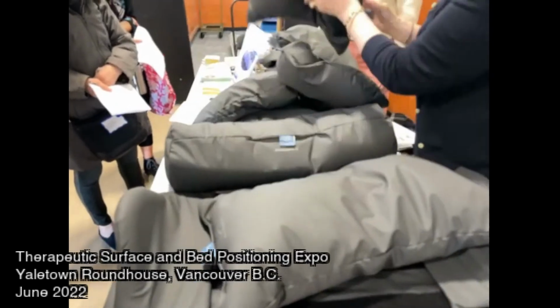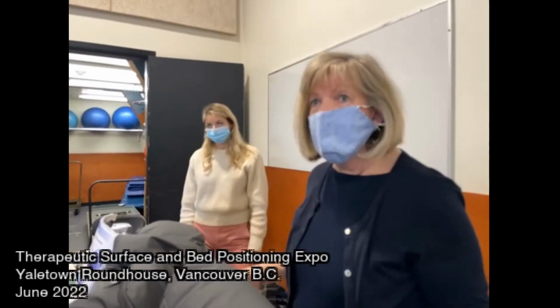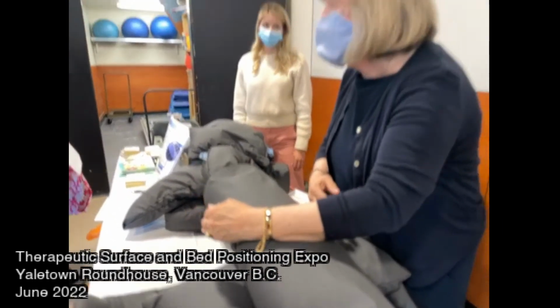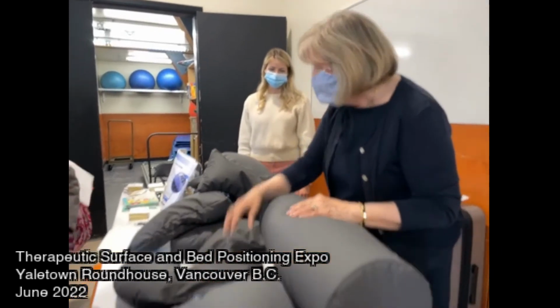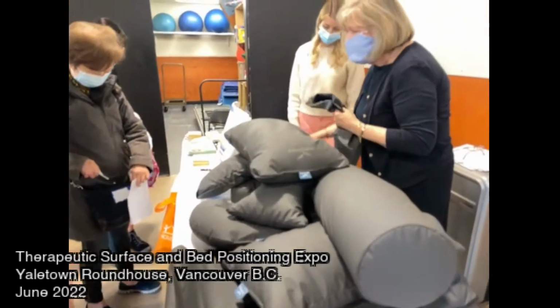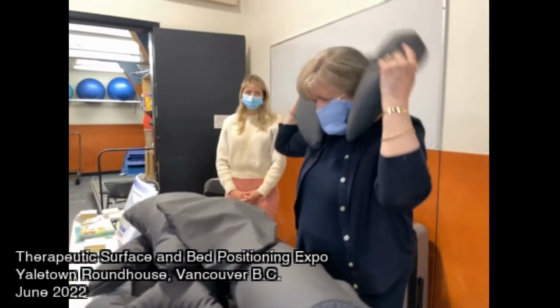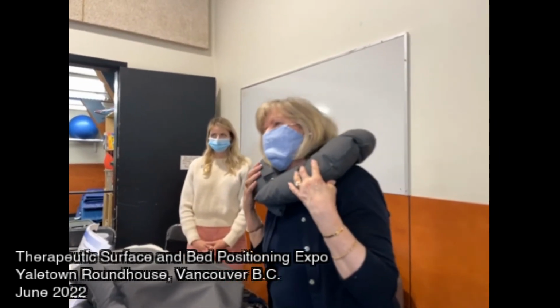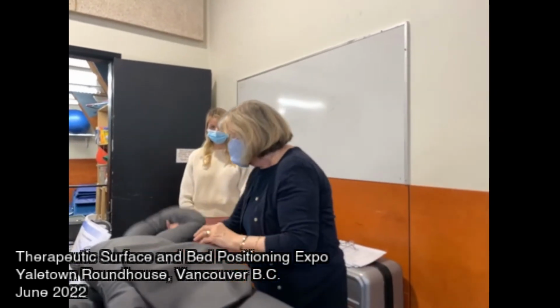The other thing she was talking about was when the client is in supine position and you want the knees to be raised up, you can put the cylinder cushion under the knees, and that will prevent them from sliding. So you get a lot of flexibility with the microbead positioning. You can also get a head and shoulder position cushion. So it works very nicely for them. You can leave it open or you can snap it. And it works great for them to position themselves both in the bed and in the chair.